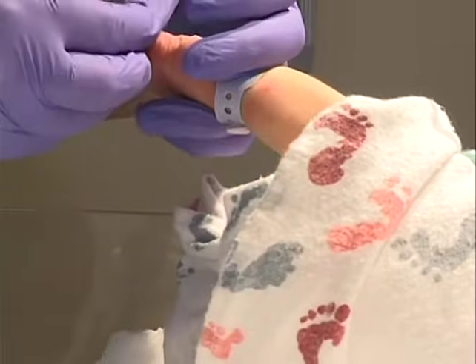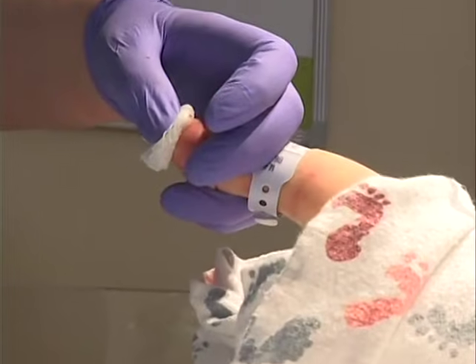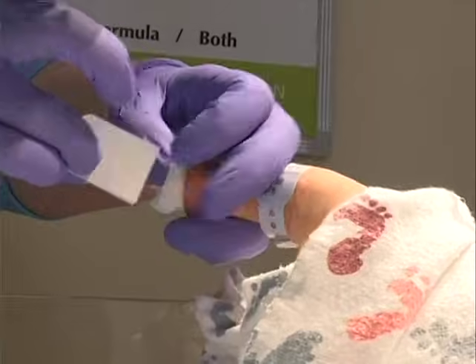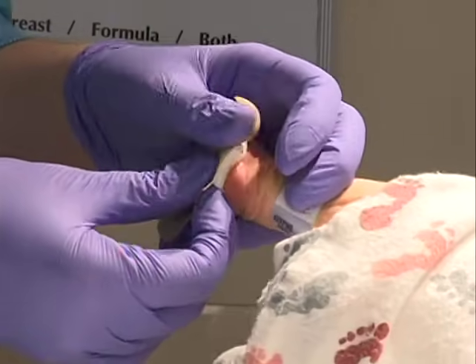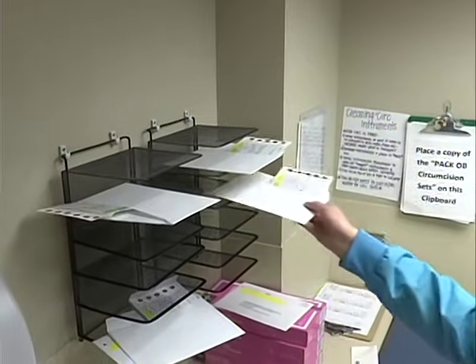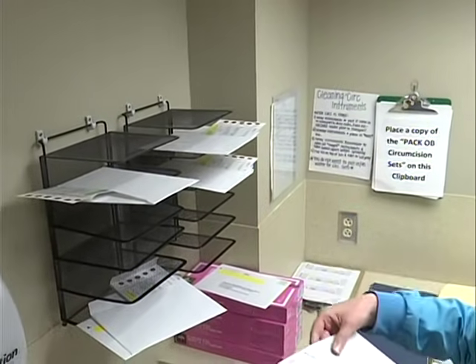After the blood has been collected from the heel of the newborn, the foot should be elevated above the body and a sterile gauze pad gently pressed against the puncture site until the bleeding stops. Avoid touching or smearing the blood spots.